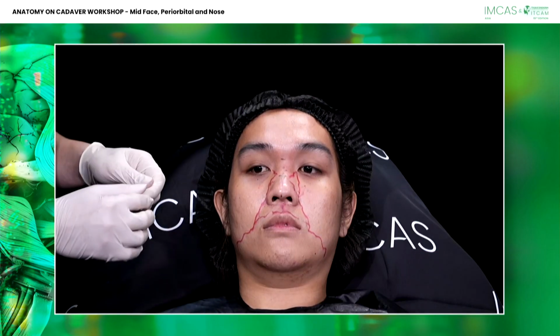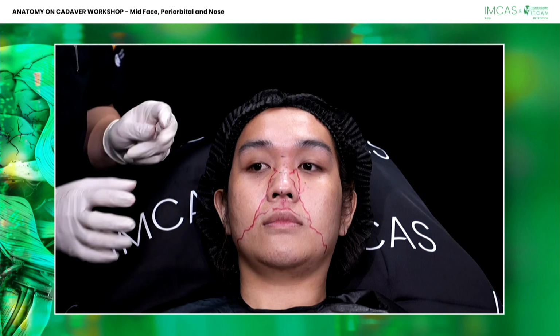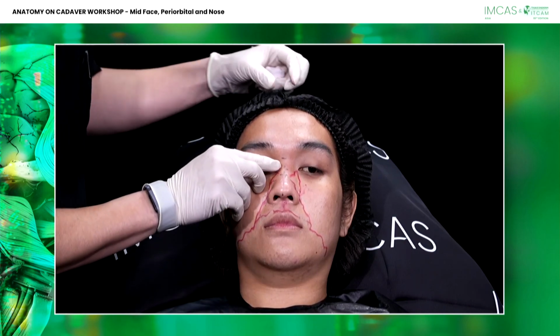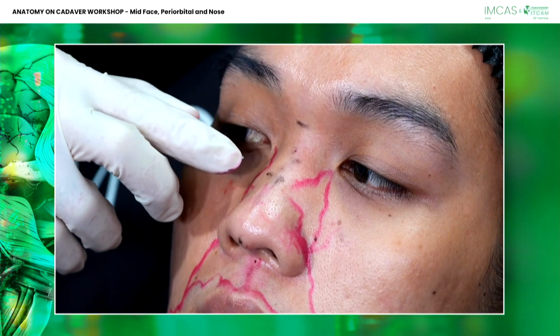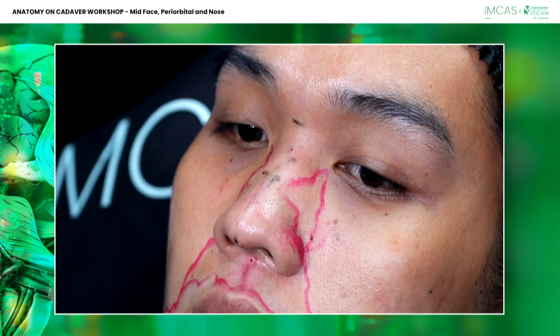But that looks like a little bit of venous, right? Can you check that syringe? But it could also be arterial. So actually I don't want to show this, but accidentally, anytime, we didn't know. Actually, I did the center, the midline, but it also can be like this. So need to be careful.